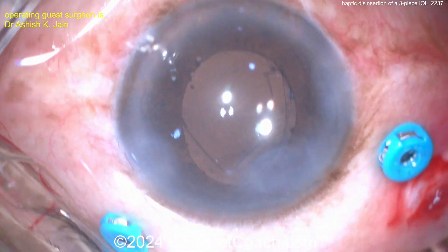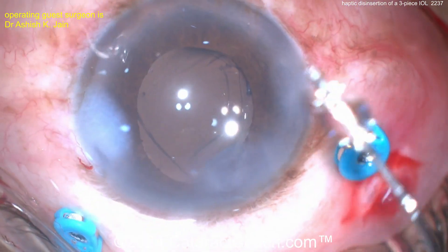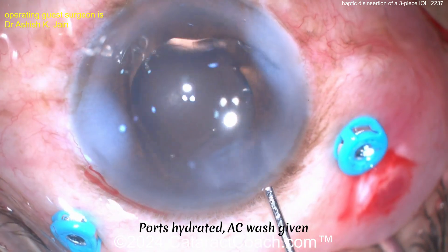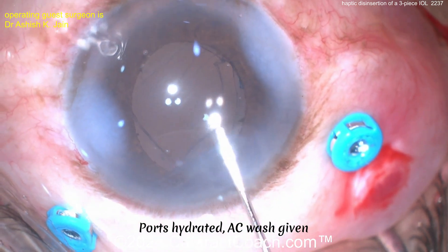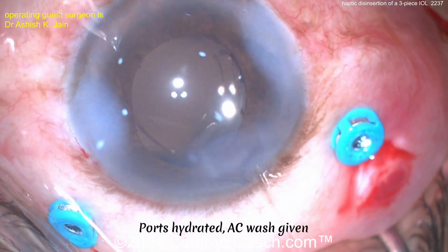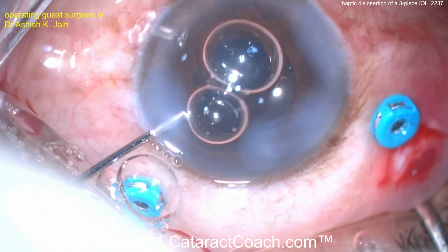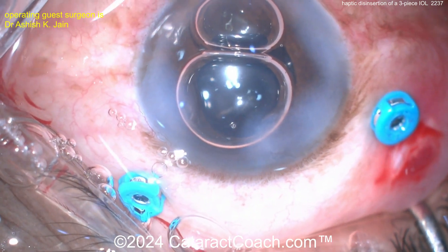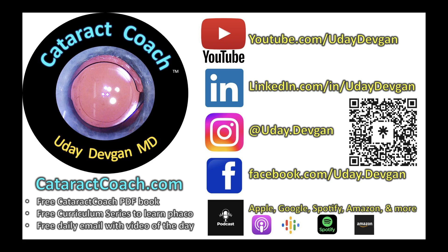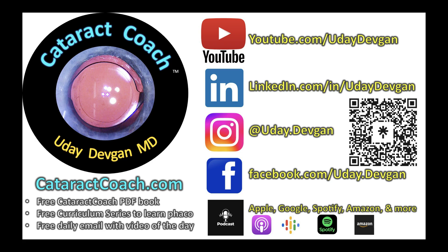A beautiful case here. Yes — now you've learned you can reinsert the haptic into the optic on a three-piece lens, and in fact that's how it was done in the factory where they were made, and it's typically not done with glue. Cool case! Check out the Cataract Coach podcast on Apple, Amazon, Spotify, and Google — anywhere you find your podcasts.